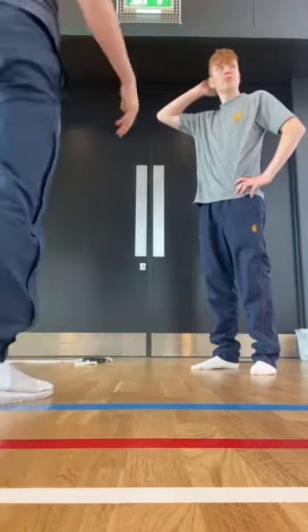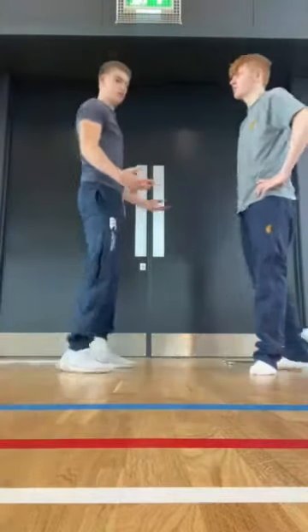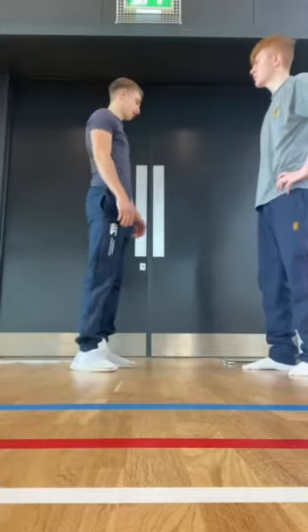Alright, so welcome to your BMI test. Before we do this, obviously, I've got a measure of height and weight — I'm calculating it.